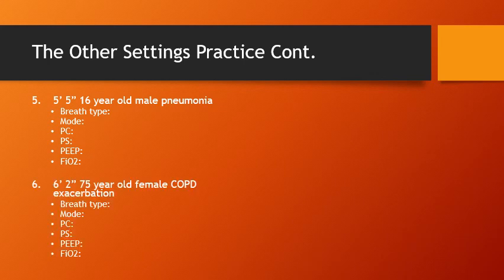Patient number 6, 75-year-old female with COPD exacerbation. For our breath type, we can use pressure control or volume control. Our mode is going to be SIMV, our pressure control 15 centimeters of water, our pressure support 10 centimeters of water, PEEP 5 centimeters of water, and FiO2 of 100%.